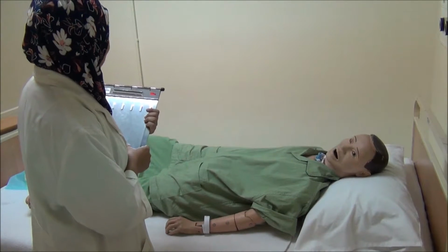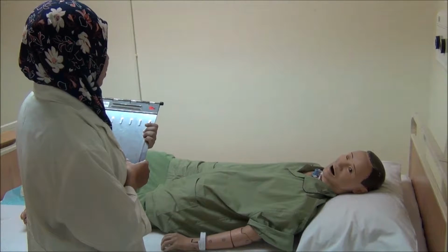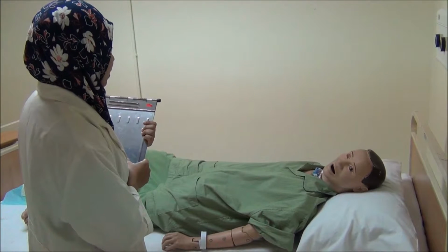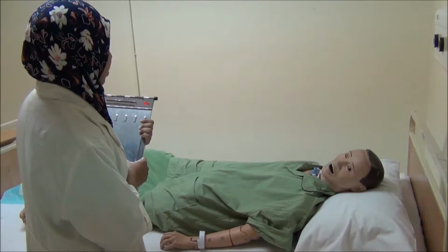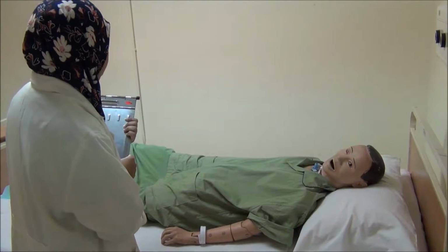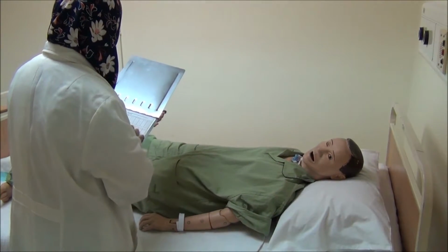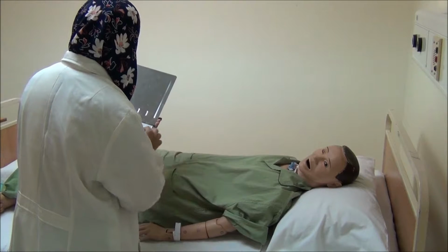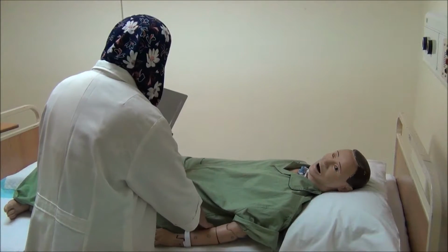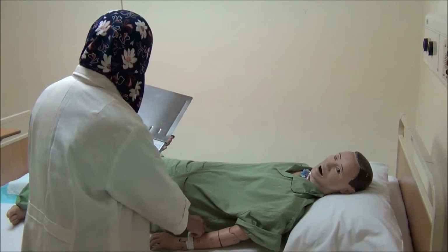Good morning, mister. I'm Izawati, your nurse today. This morning your blood sugar is 9 millimole per liter. I will give your insulin injection within half an hour. You can take your breakfast. Before that, may I know your name, please? Mr. Nick. Check the ID band. Mr. Nick. MRN number 8910. 8910. Okay.